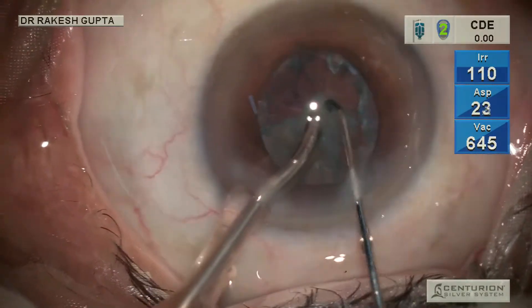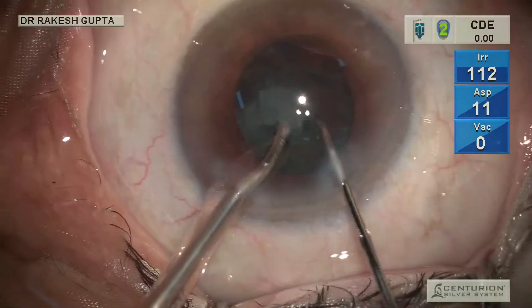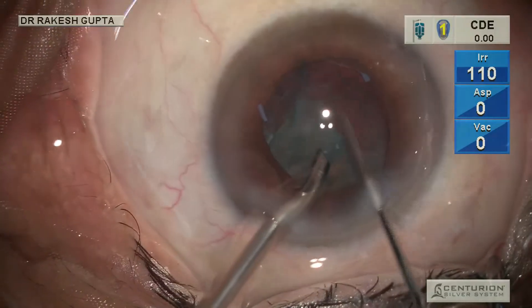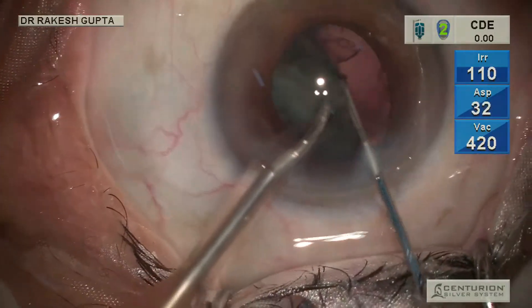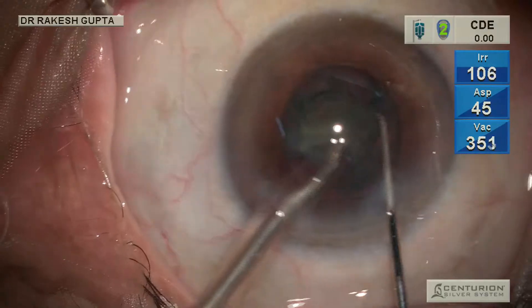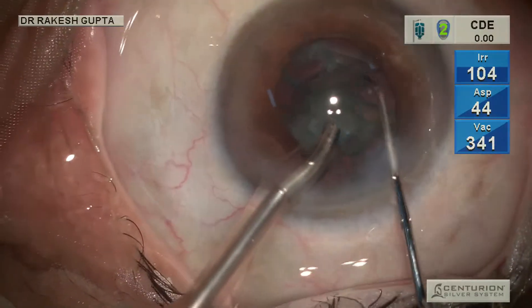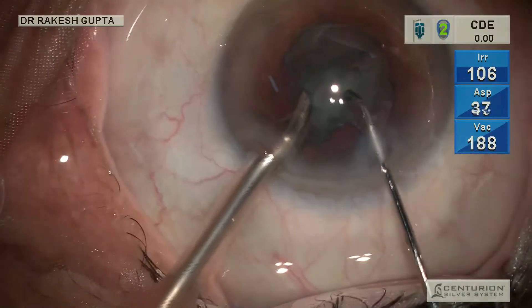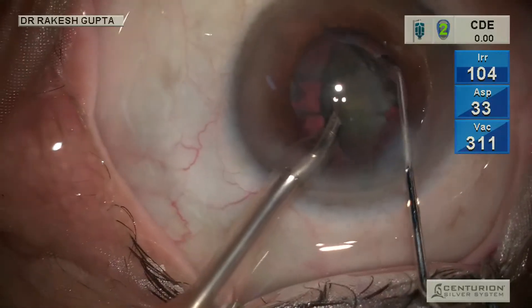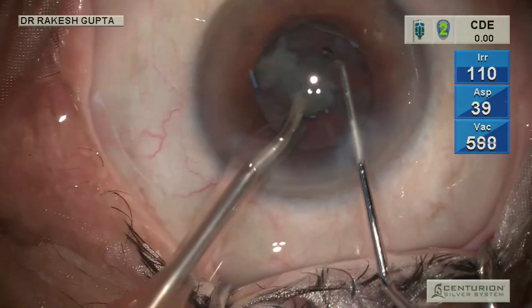The vacuum I have kept here is 700 plus — that is the maximum vacuum possible in this Centurion Silver machine. You might feel there is a risk of severe surge using high vacuum with the phaco handpiece, since 700 vacuum is generally used with bimanual or coaxial irrigation-aspiration probes. In my experience I have never felt surge serious enough to cause a complication. Even if there is mild surge, this chopper — which I have named the chopper-cum-guard — has a guarding effect. I intentionally keep it at a slightly lower plane close to the capsule so that even with mild surge, the capsule will never get sucked into the phaco probe.